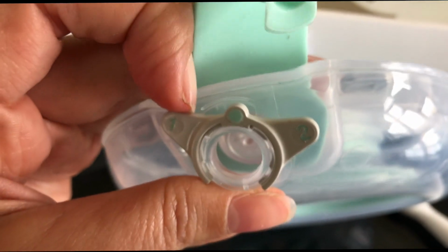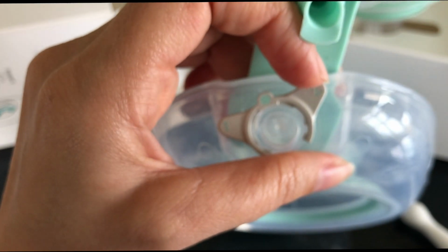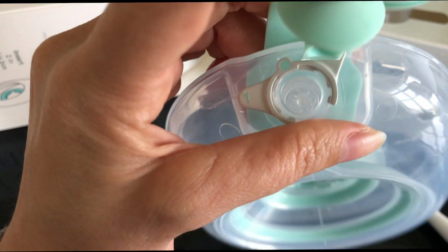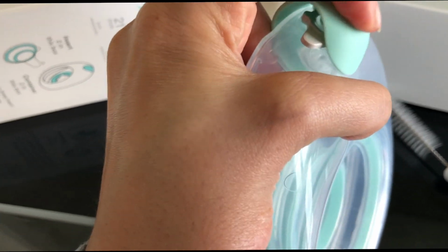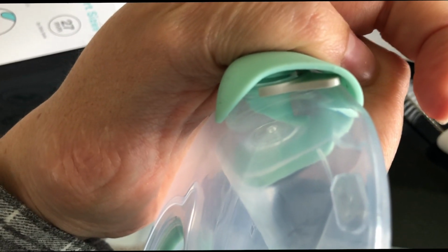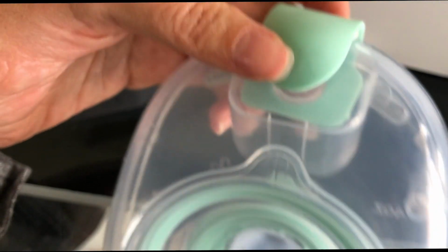But this vent hole right here is a reason you cannot lay down with the container. So you want to make sure that you're always staying upright while you're pumping. And obviously when you're on a 1 and you're trying to pump, you want this to be closed just like this. And this is the flap that I'm talking about. You see how it's sitting backwards right there. You want to make sure that that's on firmly and it's sitting backwards properly before you start pumping with the pump.